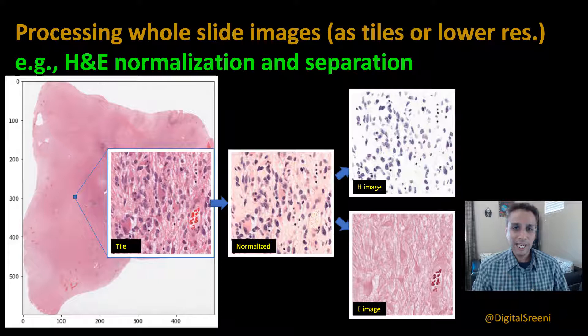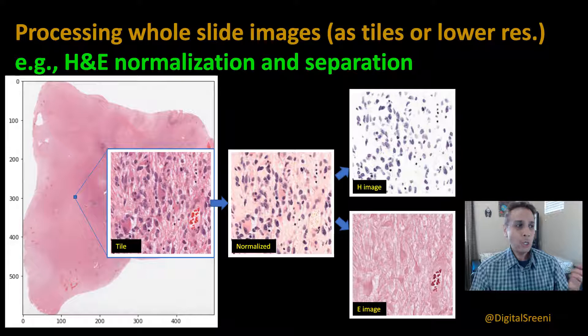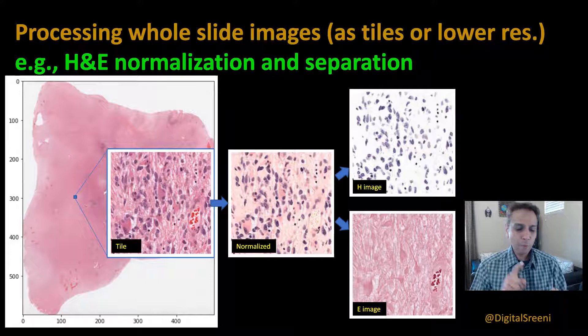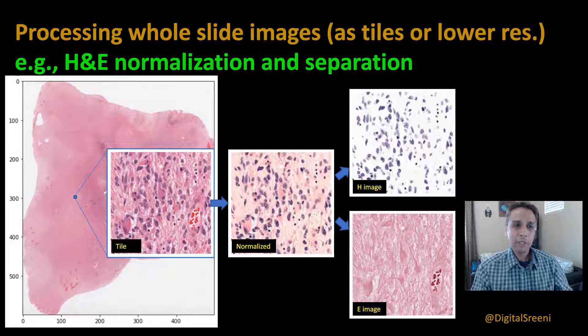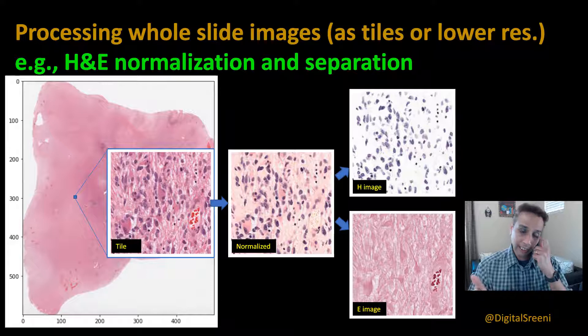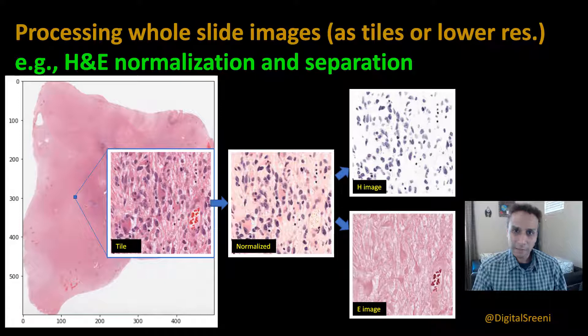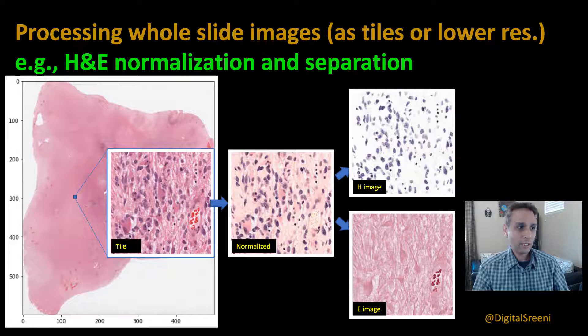This video is an extension of that, where I'd like to show you that while you're saving tiles, you can perform some processing operations. As an example, I chose the application of normalizing your H&E stained image. Why normalizing? Because if you Google search for H&E staining and look at all the images, they vary by who mixed the stains, how thick the tissue is, and a whole bunch of other parameters.